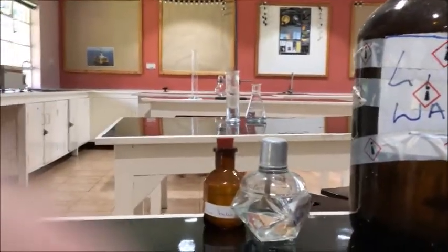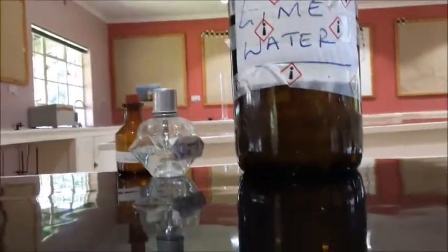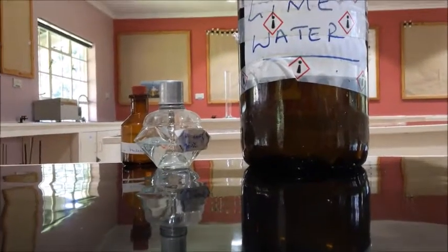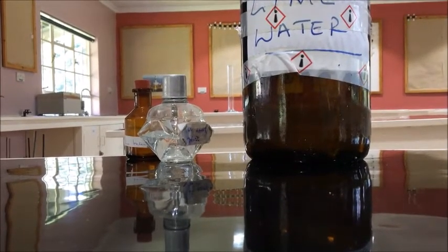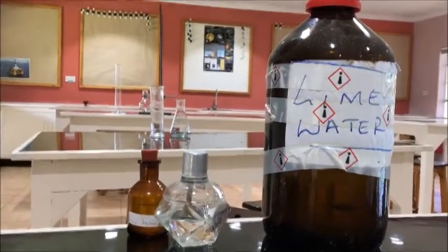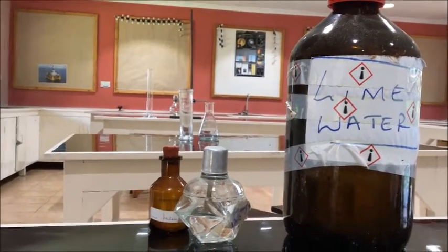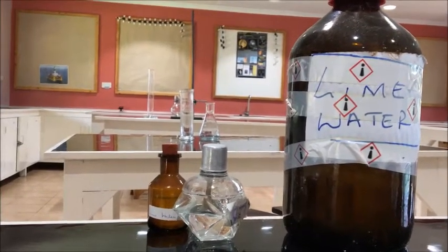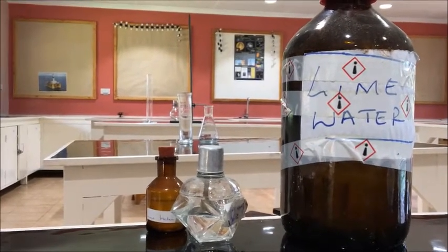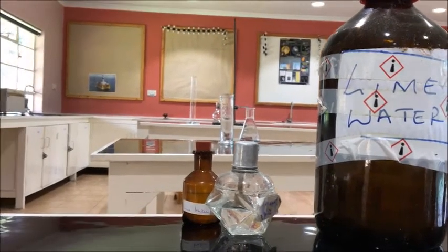If I move around, you can see that the conical flask was there all the time, but if I'm using a shadow image like that, I obviously cannot see it, because perhaps the lime water is like bone and doesn't allow me to see those things. I would much rather see from other angles like this. Now I can see the others, and I can see at the back there even the measuring cylinder. So using a method like computerized axial tomography allows me to see everything where it is from all angles. It in fact creates a 3D image. I'm going to try and explain how that is to you in a moment.